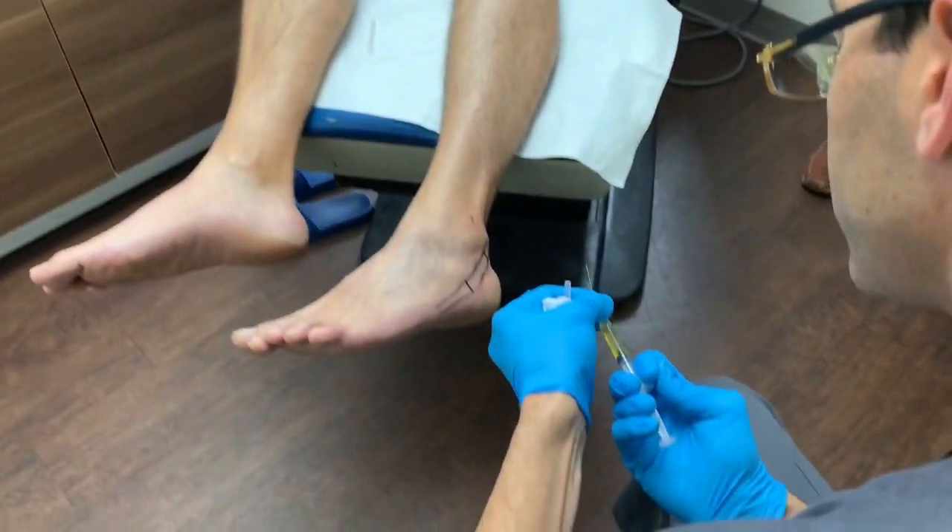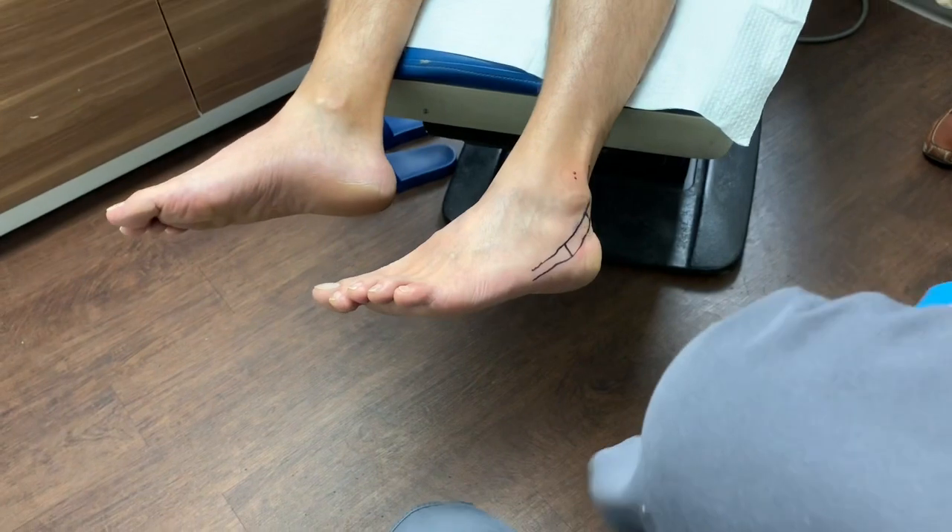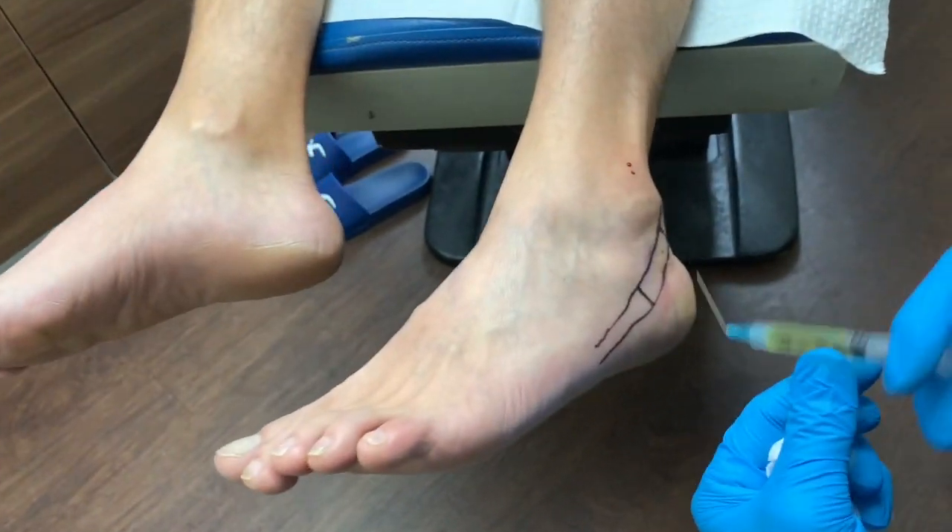Now we're going to do the distal portion here.